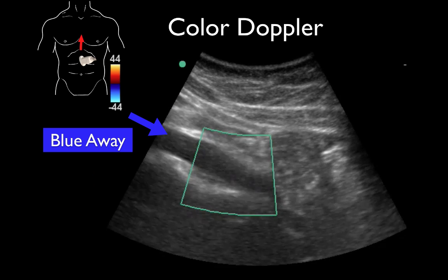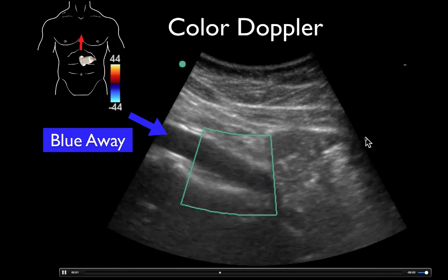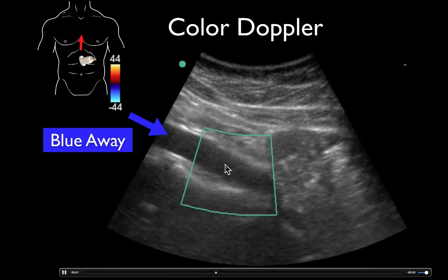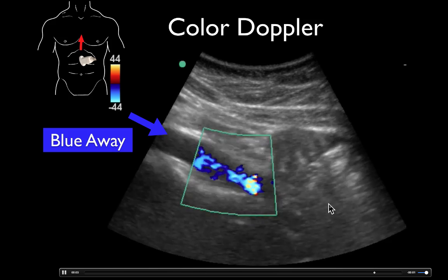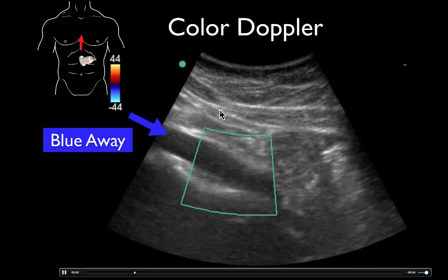Here we're scanning over a patient's abdomen, looking at the aorta. Notice the probe marker is toward the patient's head, angled down toward the pelvis — that's why we get the slanted view of the aorta. The blood flow is traveling deep and away from the probe at this angle, so we get the blue color. It's important to remember that red and blue have nothing to do with which vessel it is — they only indicate the direction of flow relative to the probe. These machines cannot tell you what vessel you're looking at, so don't assume that.